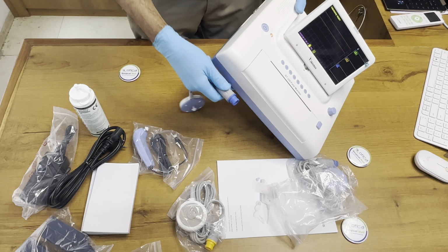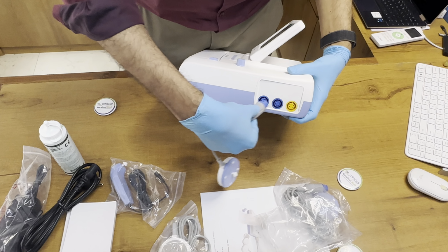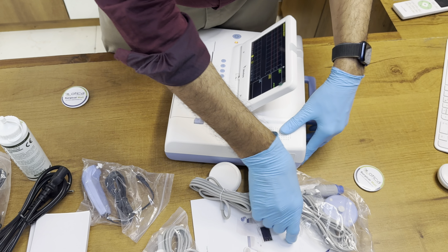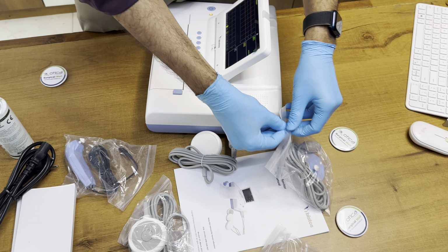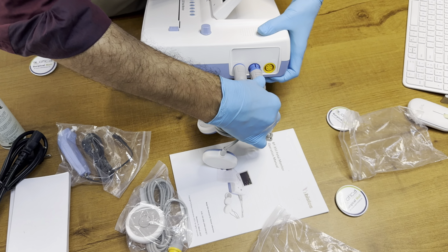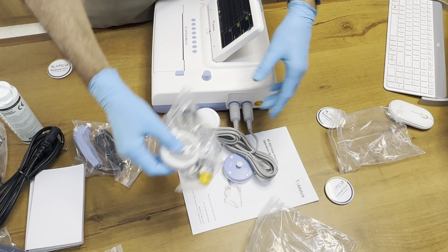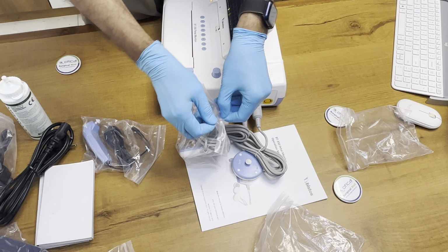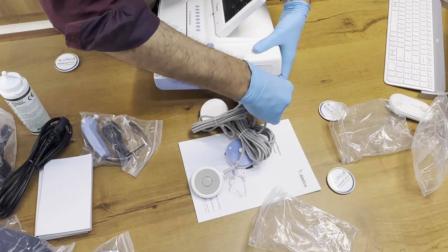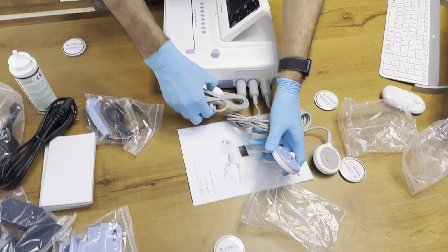They have given the color coding. You can connect according to the color. You can put this blue probe in any one side. Then one more is there. Just a minute. This is FHR, we can say ultrasound 2, and this is the tocography probe. So we have connected these three different probes.